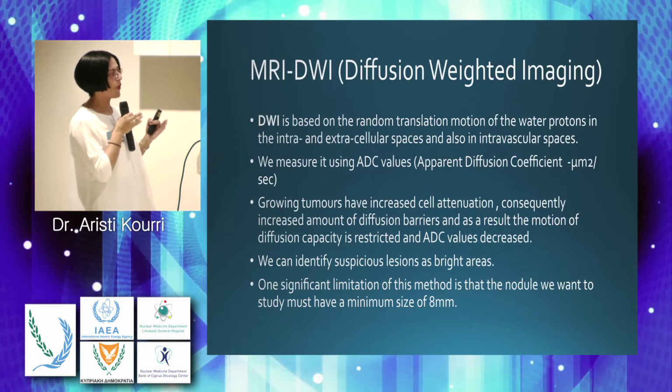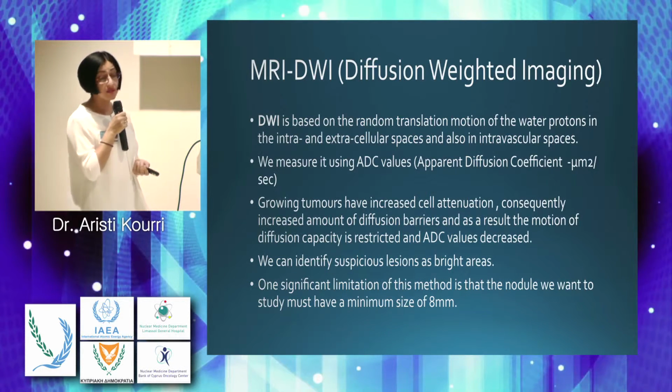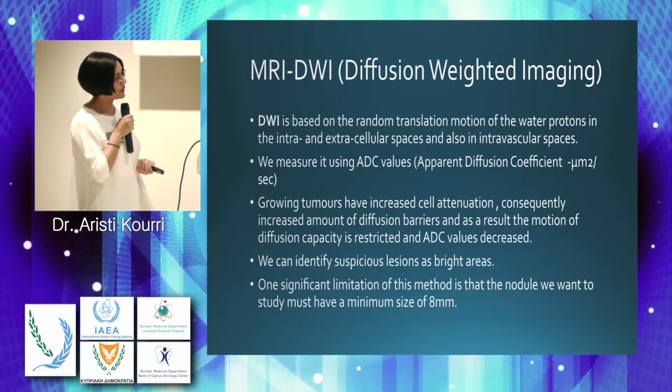These give us bright areas in the areas of pathology. One significant limitation of this method is that the nodule we want to study must have a minimum size of 8 millimeters.